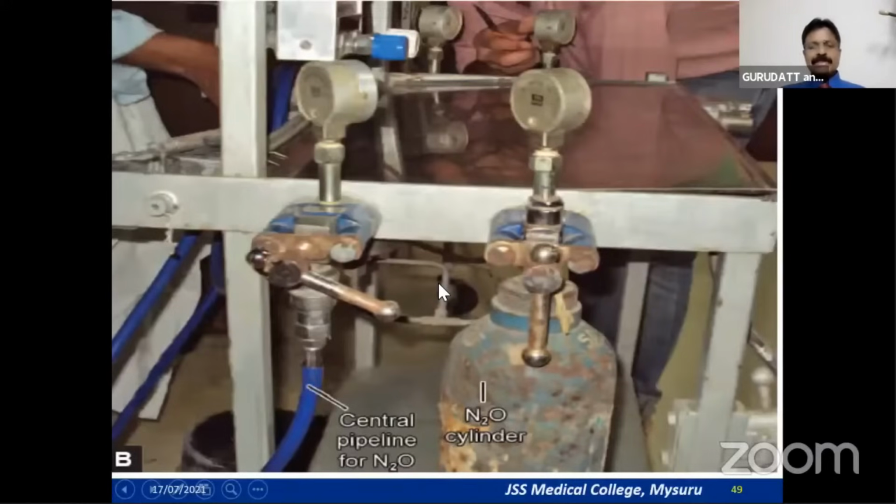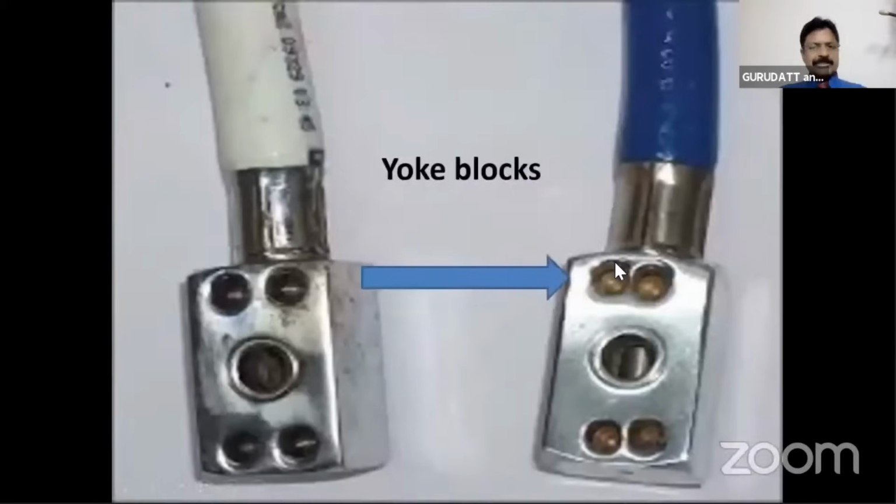and in the older machines the pipeline used to be connected directly onto the yoke, and how it is connected directly onto the yoke is by using what is called a yoke block. So you should always remember to differentiate between a yoke plug and a yoke block. The yoke block is mainly to connect the pipeline onto the yoke assembly. So see, these are the yoke blocks. They almost look like cylinder valves.